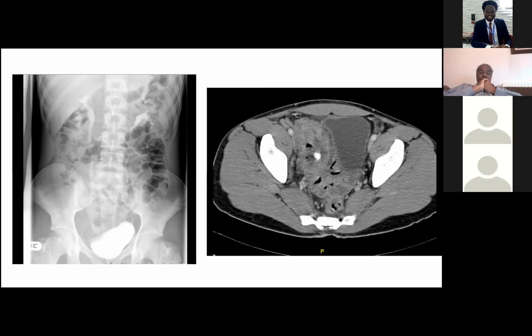And the danger is that what you think is a normal X-ray can hide a lot of significant pathology. Therefore, this is an example of a case where there was a significant delay in diagnosis, 2 days from the original presentation. You could make an argument that clinically, if there was a better clinical assessment, they should have gone on the basis of symptoms.